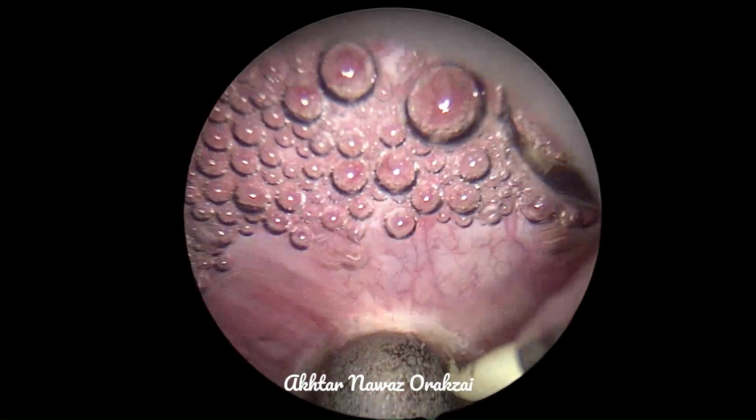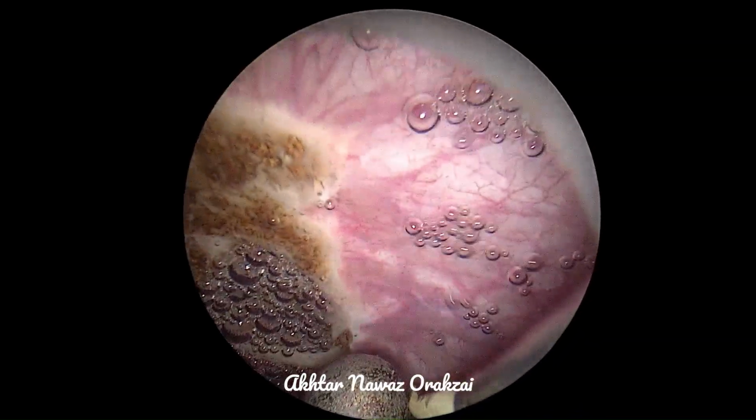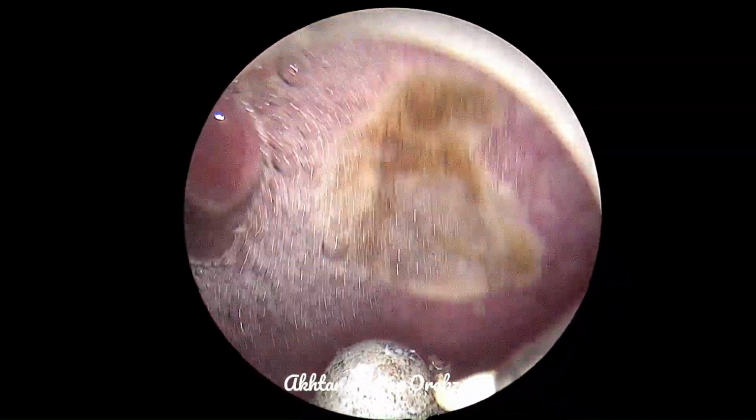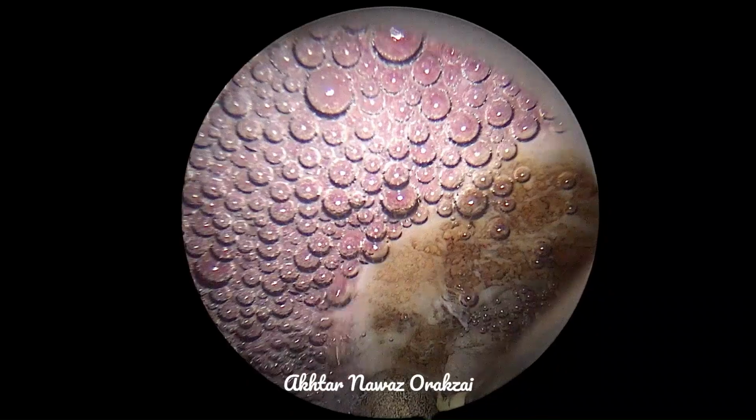So this should be kept in mind, number one. And number two, the angle should be wide. You should not be close to the mucosa. The angle should be wide.